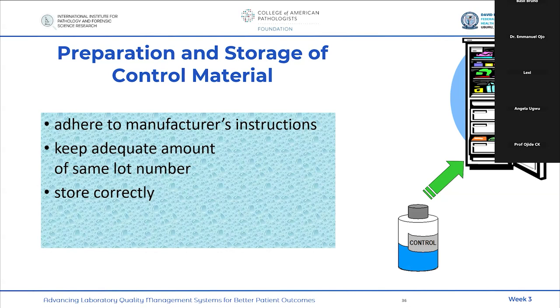Of course, this is subject to what has been practiced and demonstrated, and this can be documented to guide scientists on the bench to say this is for how long you keep this before you can run the QC on your analyzer.